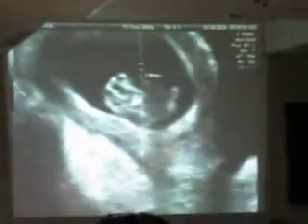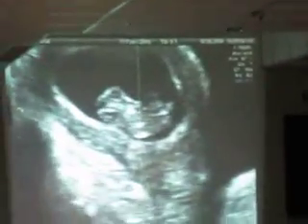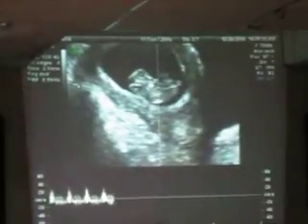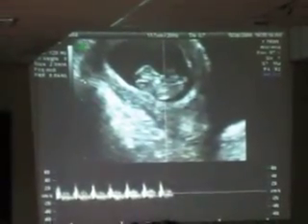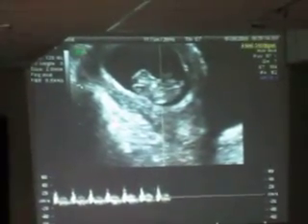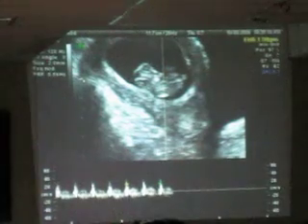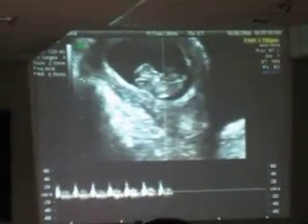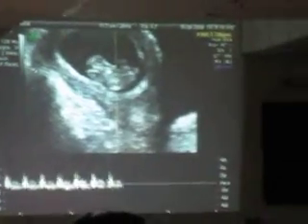If it is less than 70, then I would certainly call her back in a week's time. If it is around 90 or so, I'll go for the 11-week scan straight away. She is asymptomatic, so I don't need to do anything in between. I'm just a passive watcher here.